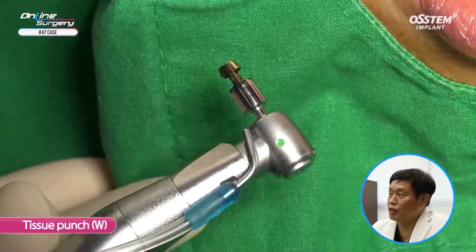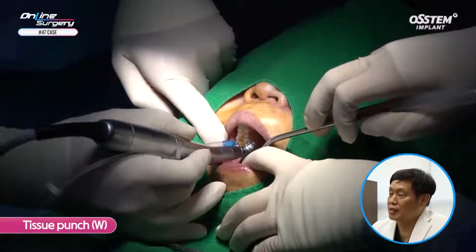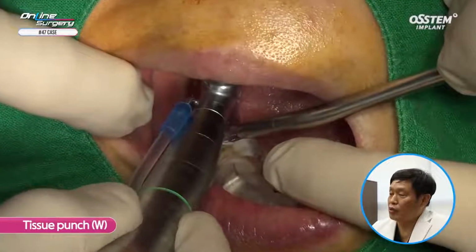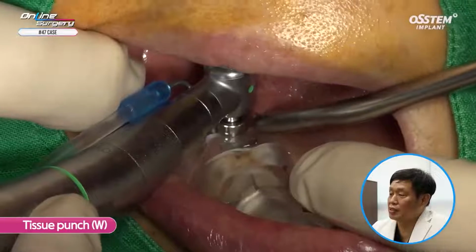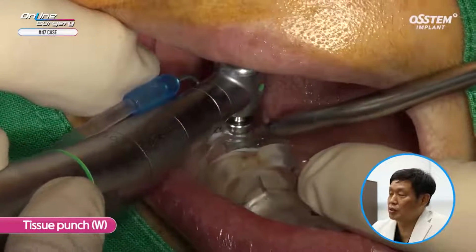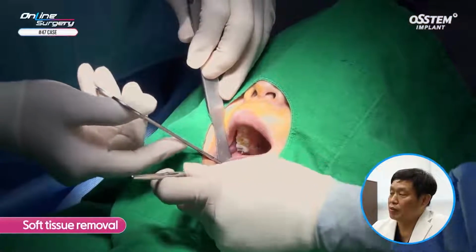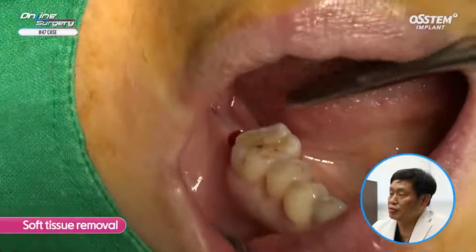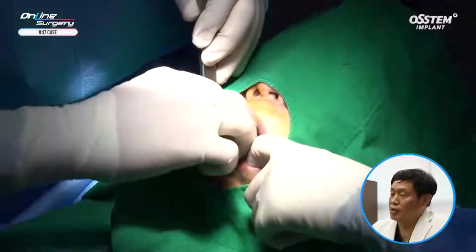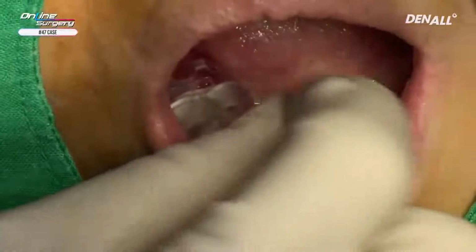A tissue punch is used to remove the gingiva. This is a wide hole. You can use the wide one, which is the gold one. A tissue punch is used to remove gingiva. The guide is removed. I'm checking once again whether the tissue punch has been done properly, and now I'm adapting the one guide template.